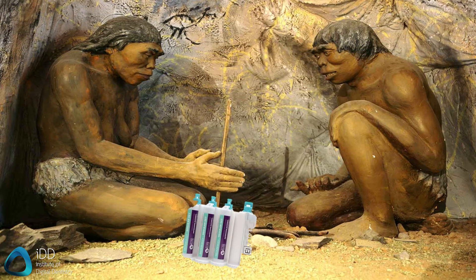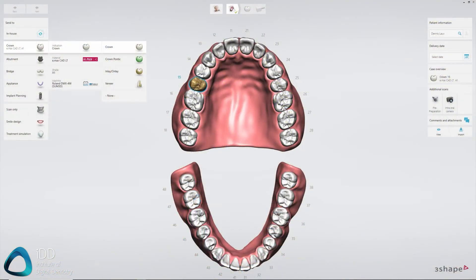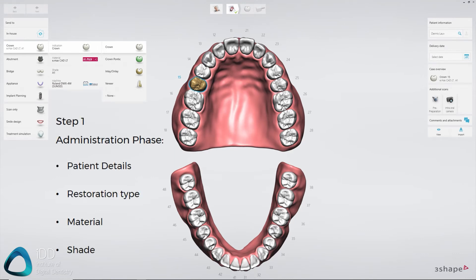Before you take a scan, you must fill out a prescription or lab form. Similar to the physical forms you send to your local lab, these involve choosing a tooth, a prosthesis type, indication, material, and shade. Once you've done that in the software, you can carry on to the next step, which is scanning.